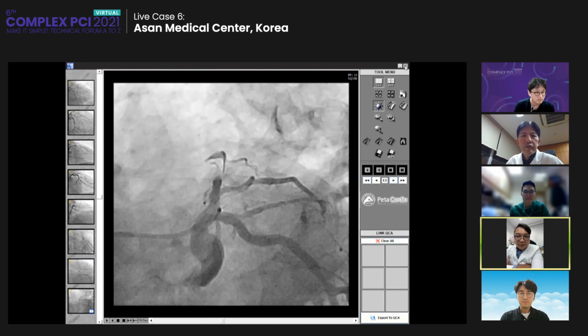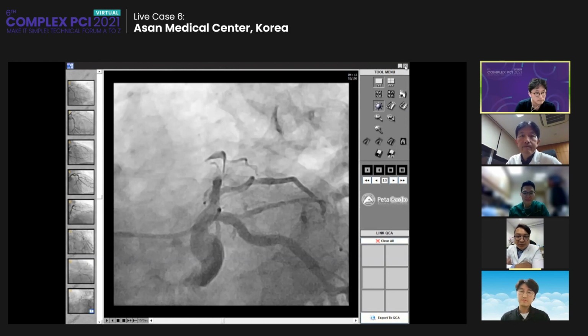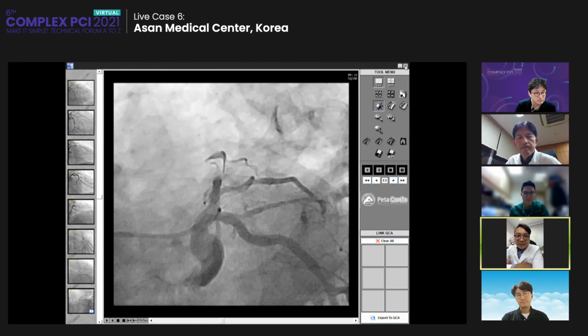Hi, Dolly. So this is Yuho. Yes. So I think the proximal cap is tapered. Therefore, we can consider starting with the antegrade approach. Of course, we need to put in a catheter to make contralateral contrast injections because the CTO ends before the bifurcations, and this is a reattempted case.